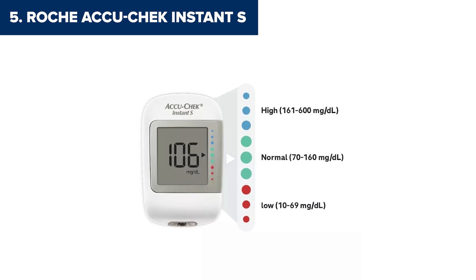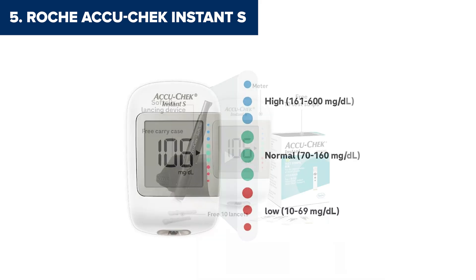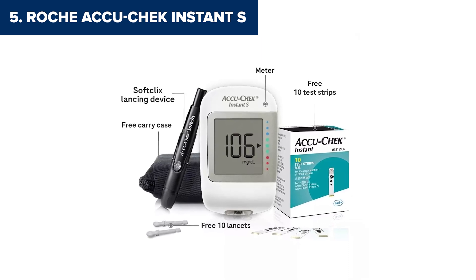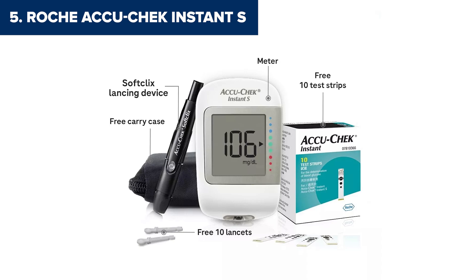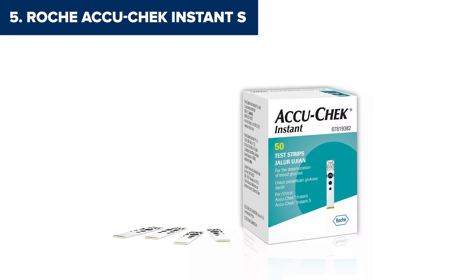Here's where things fall short. The memory is limited and there's no Bluetooth connectivity, so you'll need to use a USB cable to transfer your results. Compared to the others on this list, it lacks the modern conveniences many of us have come to expect. If you're looking for a no-frills device that just focuses on the basics and you don't mind the old-school connectivity, this one could be a solid choice. But if you're after something smarter, keep watching.